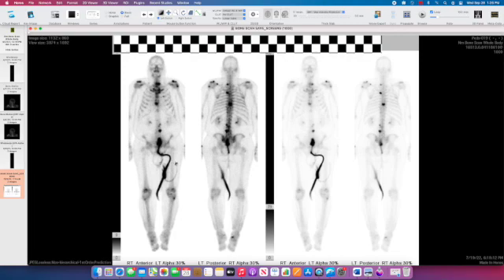This patient actually has an indwelling catheter, so that's this linear intense activity here in the catheter tubing. In summary, this patient has multiple osseous metastases predominantly in the spine, but also in the left sacroiliac region and left humeral head.